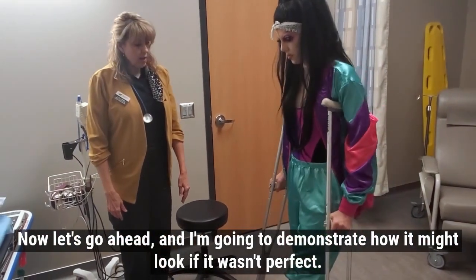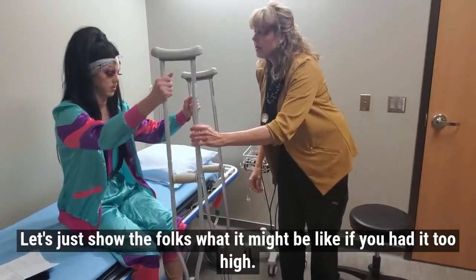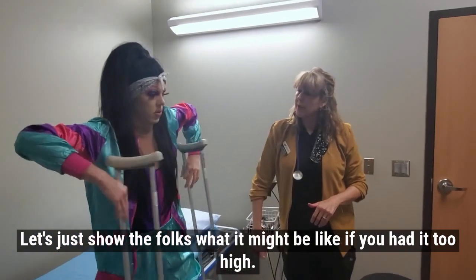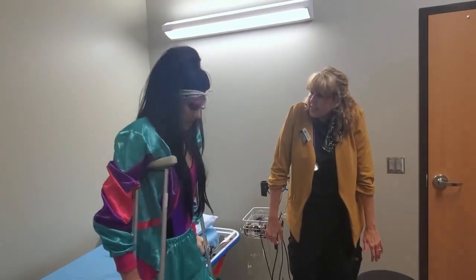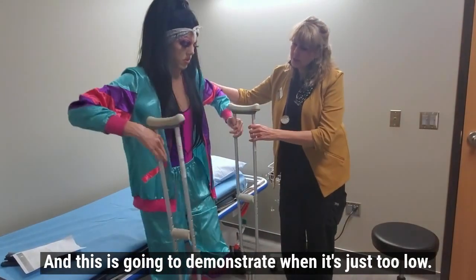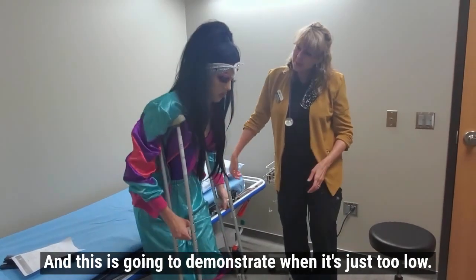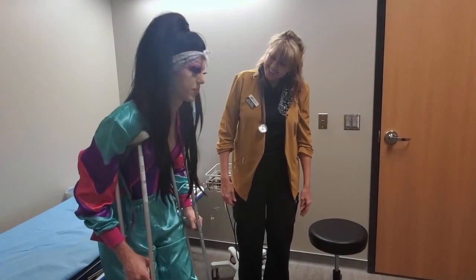I'm going to demonstrate how it might look if it wasn't a perfect fit. If the crutches are too high, it feels like a bunch of pole vaults. And this will demonstrate when they're just too low — you feel like the hunchback. Yes, exactly.